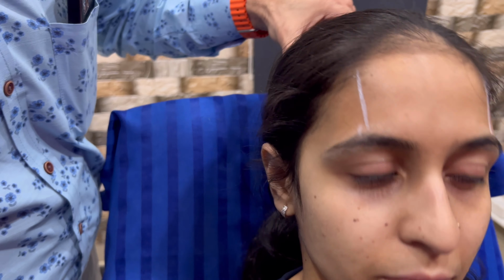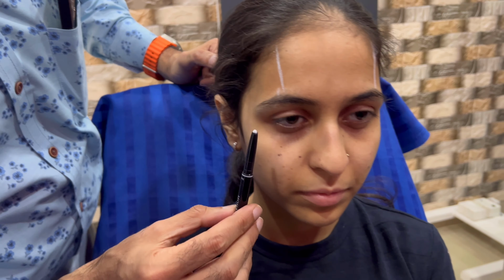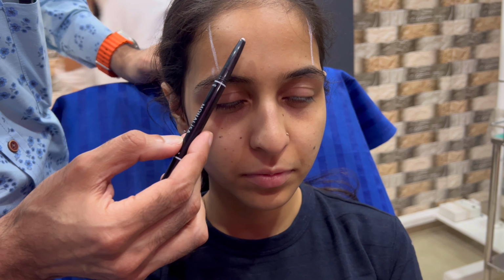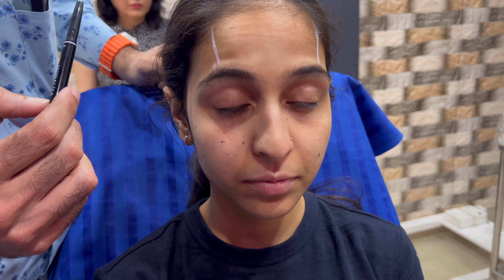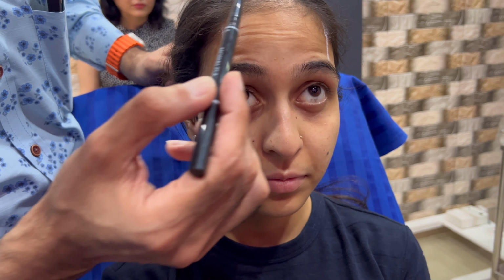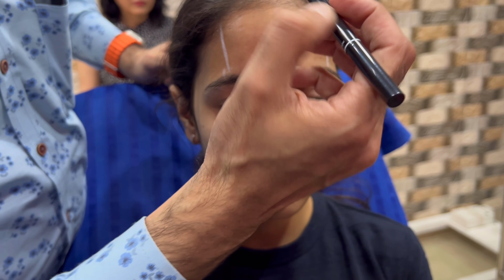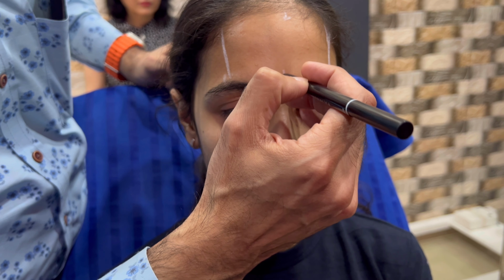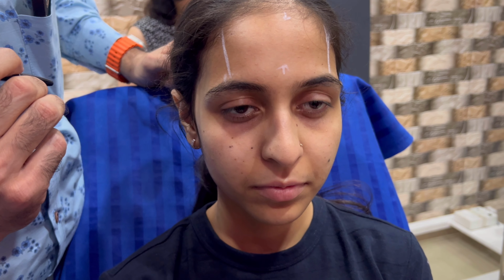Now when she sits up, look straight. When she looks straight, see the line corresponds with the lateral limbal line. Yes, to most people. Now the next step is I have to ask her to look up as much as you can. Okay, down, one more time. See now what is happening. Relax. Now you will see this portion go this direction, this portion go this direction. Do one more time.